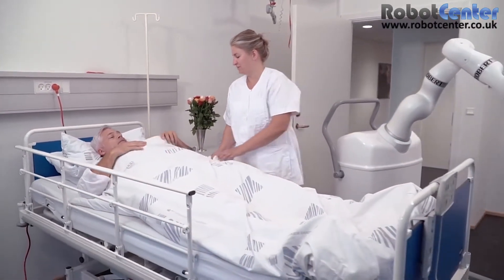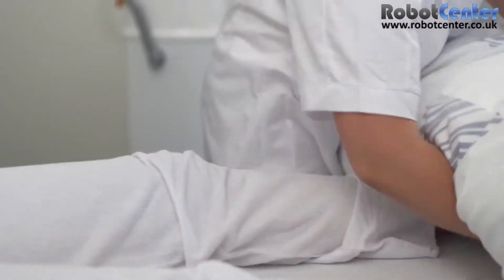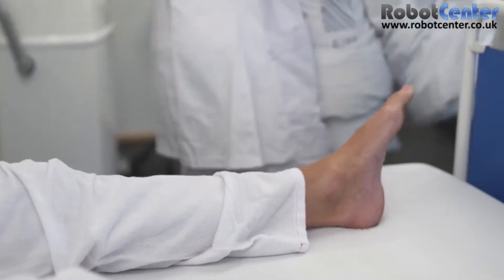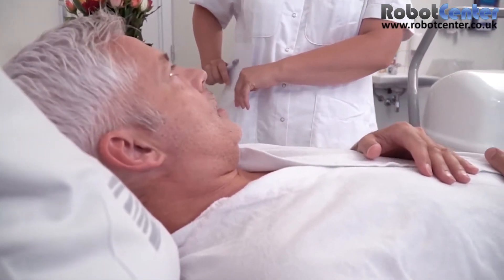The practical design of Robert means that it can easily be moved from one room to the next. Therefore, the patient can remain in bed and focus on the therapy, thus avoiding the transfer to a training facility or to another bed.